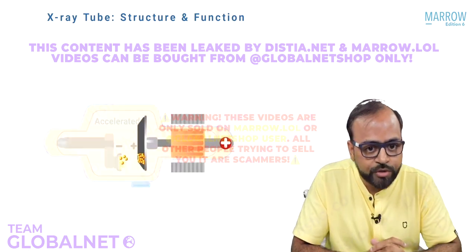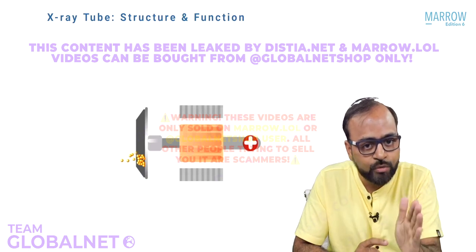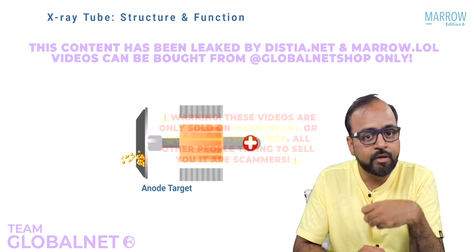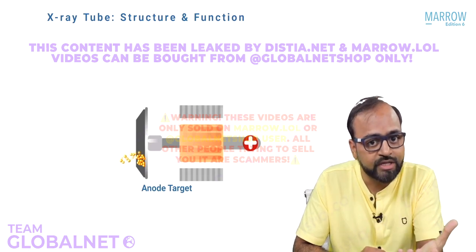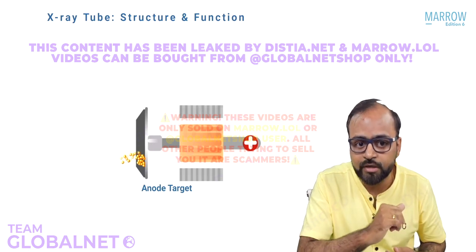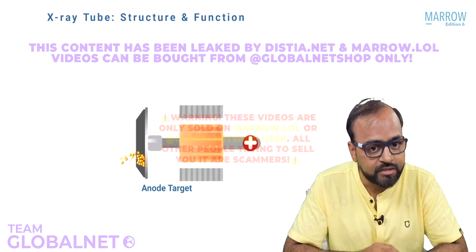What will happen? Let us shift our focus now to the anode. Look at the anode. What is going to happen? There is a high velocity stream of electrons coming and hitting the anode, and therefore it is called the anode target because it is getting hit. A lot of heat is going to be produced at the anode, and therefore the anode must be of very high atomic number. It must have a very high heat tolerating capacity, isn't it?